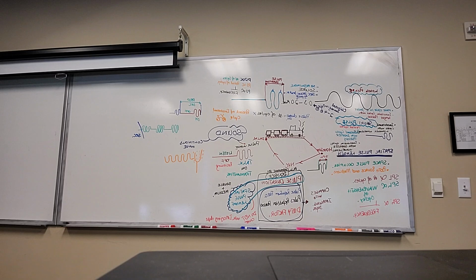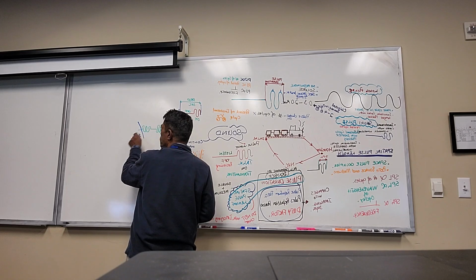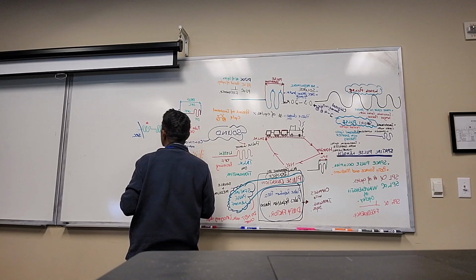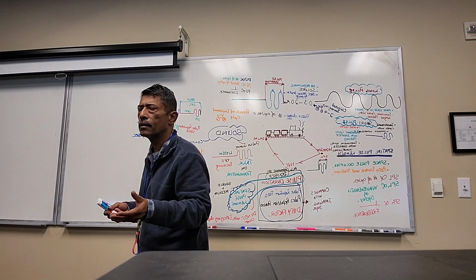By decreasing PRF, what does that mean? In 1 second, say here in this case we're transmitting 3 cycles per second. That's a high number of cycles per second. That's the definition of pulse repetition frequency: 3 pulses per second.